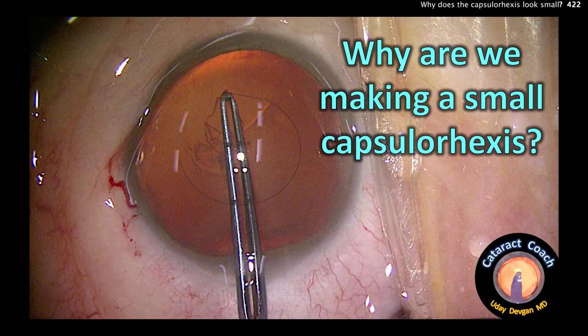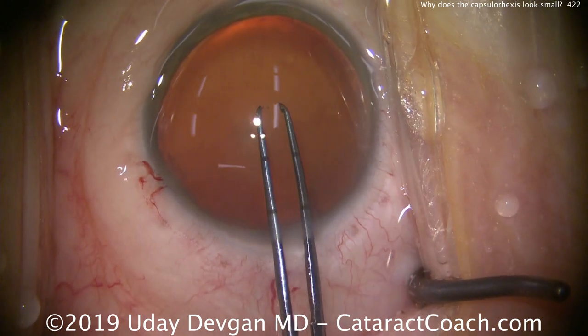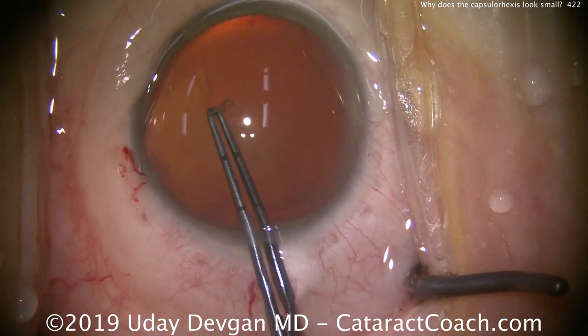Why are we making a small capsulorrhexis in this case? Take a look. We've already made the incision. We'll put the forceps in the eye and start the capsulorrhexis right here in the middle, poking in with the forceps to get this started.